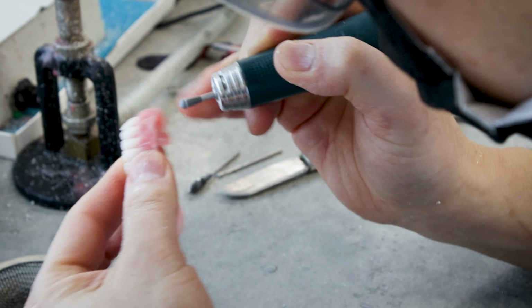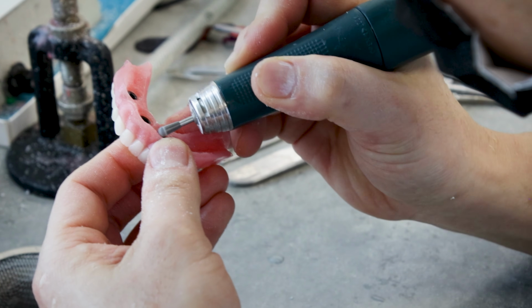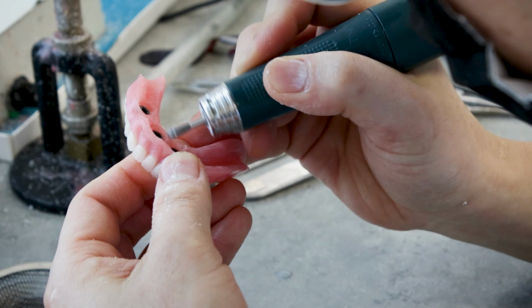The idea behind removable dentures is that they can be removed for ease of cleaning of the dental implants and the denture itself. Making the decision to extract teeth is always difficult, and I always err on the conservative side of trying to maintain teeth.